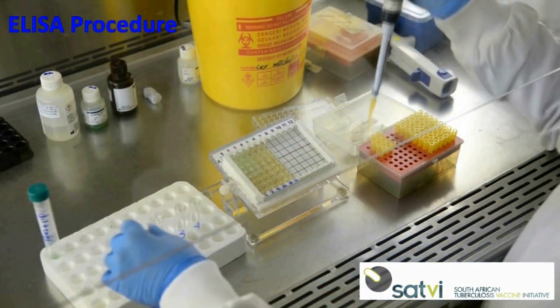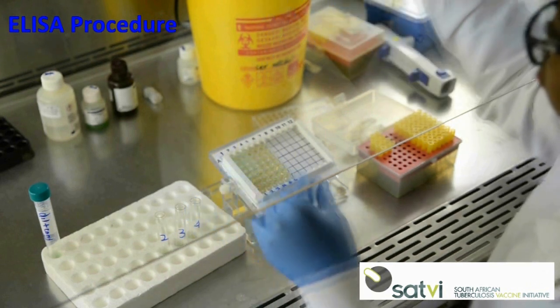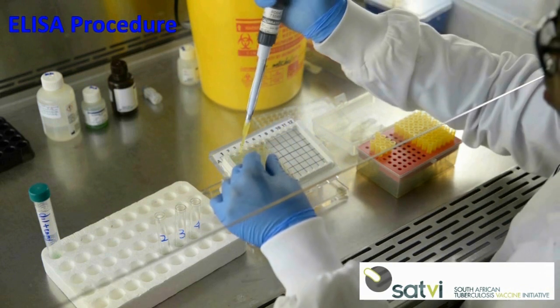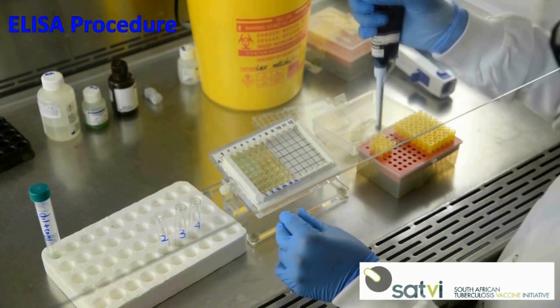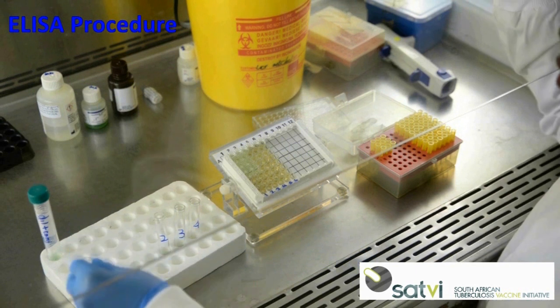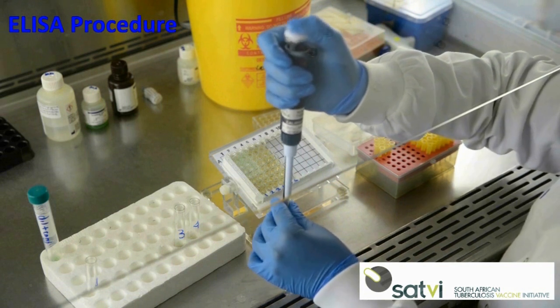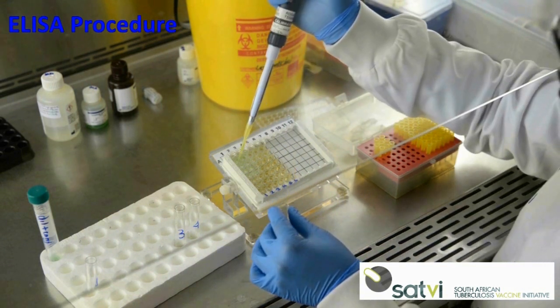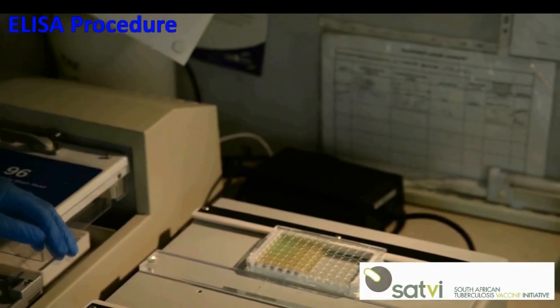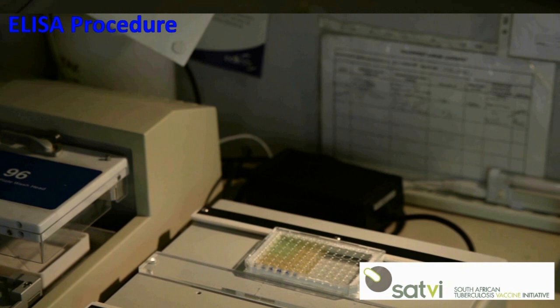Add 50 microliters of standard to the wells assigned to the standards. Add 50 microliters to the remaining assigned wells.